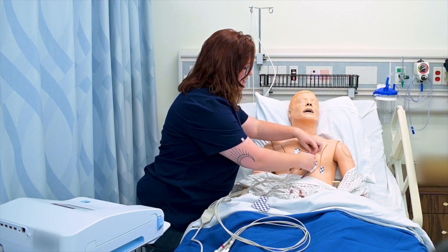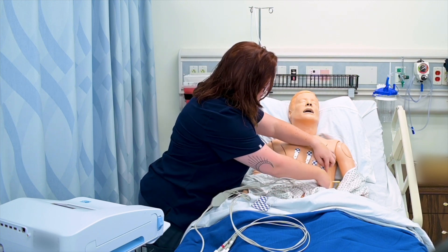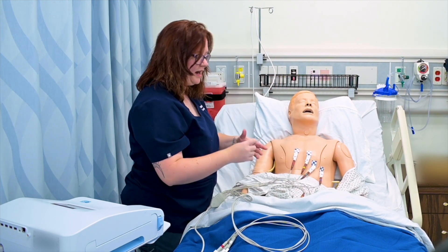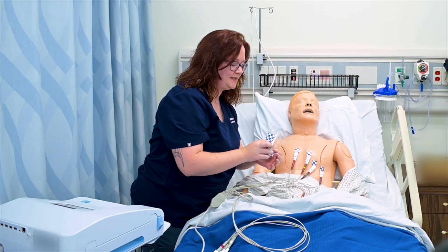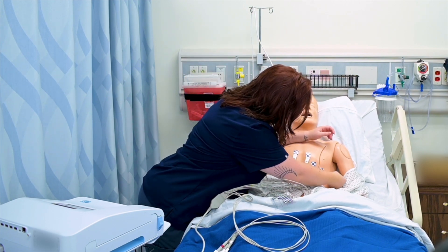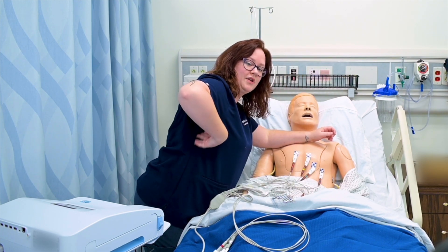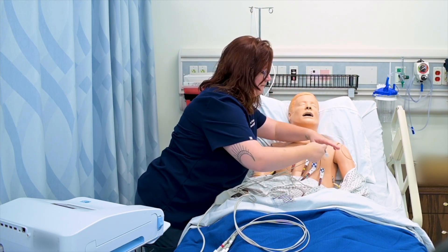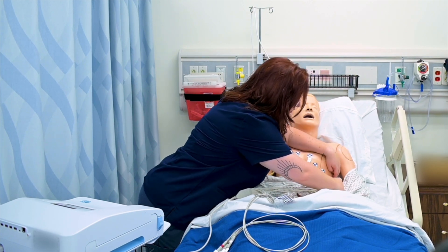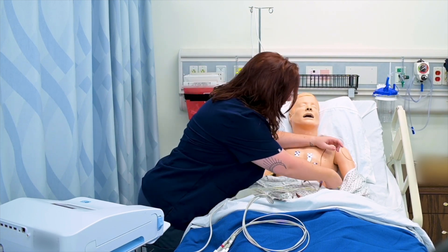Honestly, about 60% of this skill is just untangling lines. Kind of like how I skipped before, I'm going to skip again. Instead of doing V5 first, I like to go ahead and place V6 because it's mid-axillary — right in the middle of the armpit. That's V6. And V5 is in between V4 and V6.